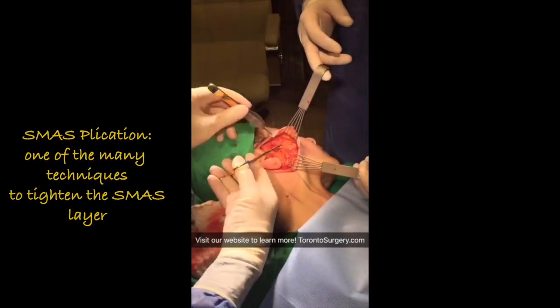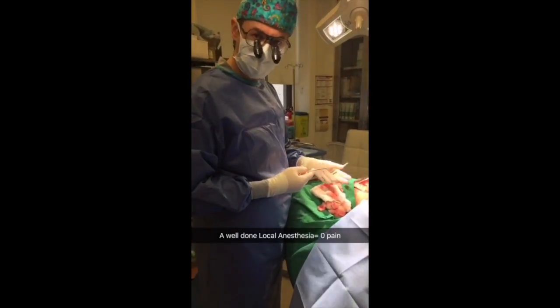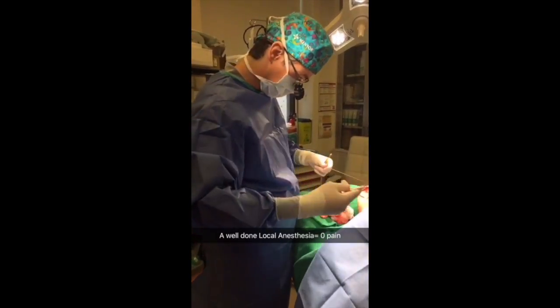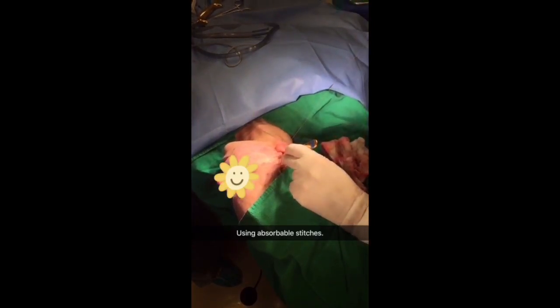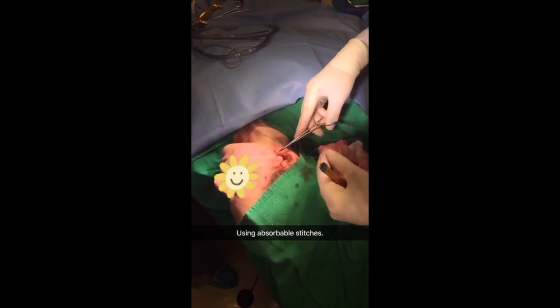Are you feeling anything? No. Good. The beauty of doing a good freezing is that she's fully awake and feels absolutely nothing. These are absorbable stitches — deep stitches that are going to be holding tension, so the skin itself will not be under tension and the scars will heal beautifully.